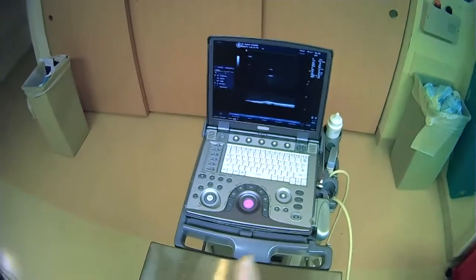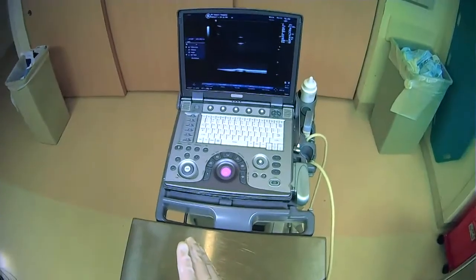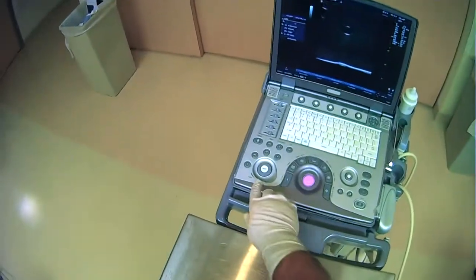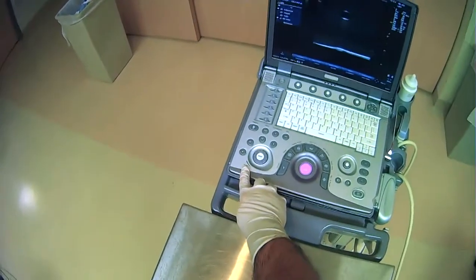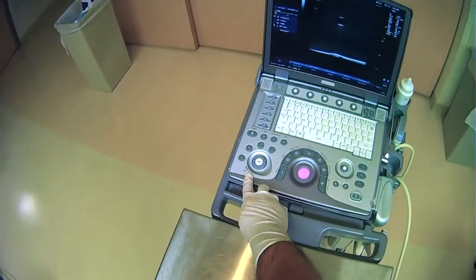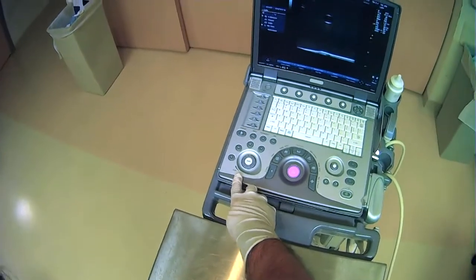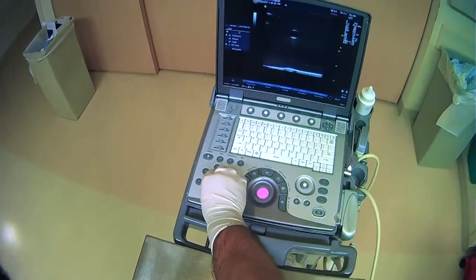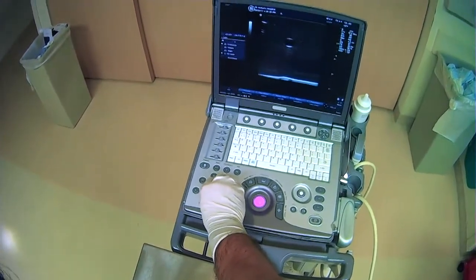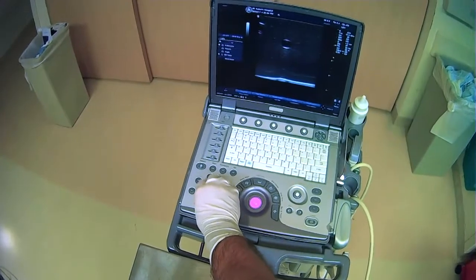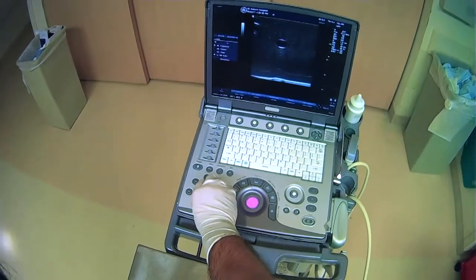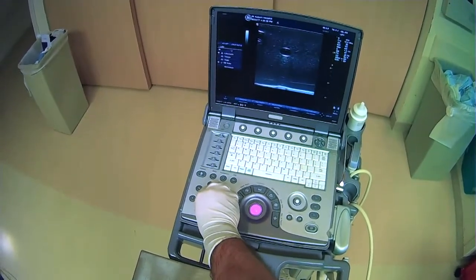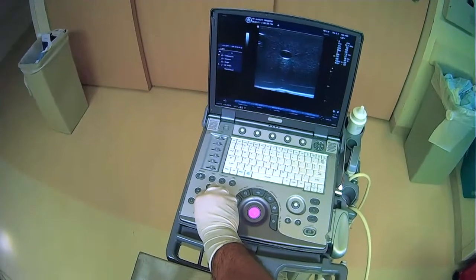As a few quick examples to establish this point, there's something called gain that's found on ultrasound machines. This will change essentially the brightness that we see on the screen. Here I'm just turning up the gain so we can visualize everything a little bit better.